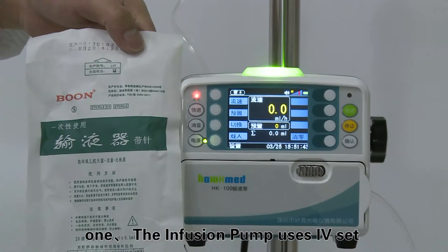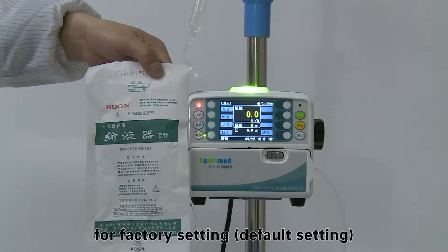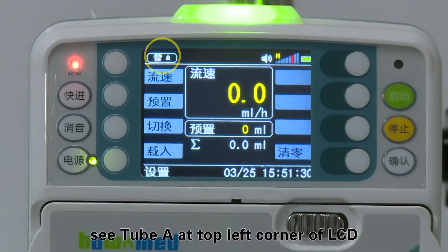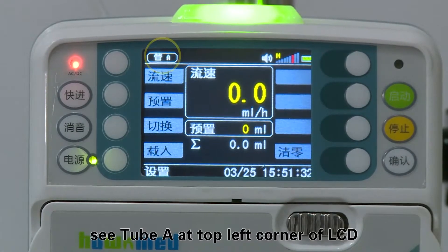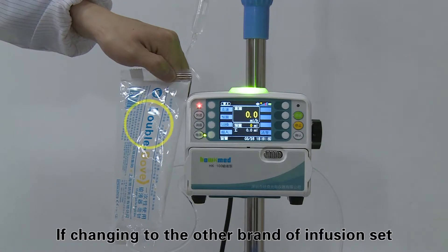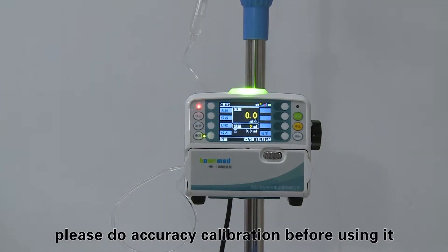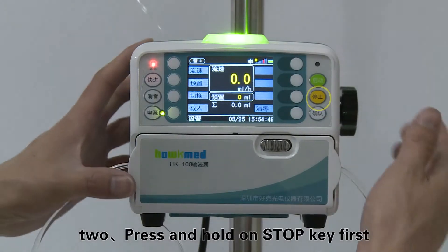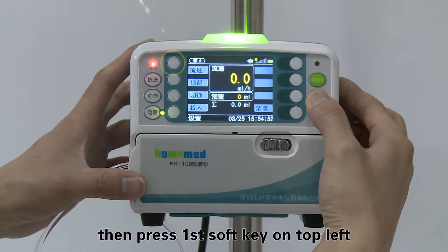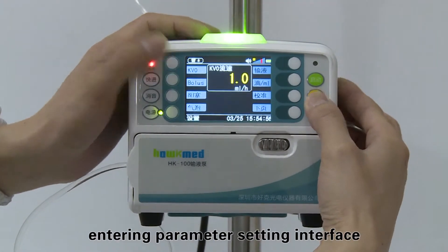The infusion pump uses an IV set under the brand of Boone for factory default settings — see tube A at the top left corner of the LCD. If changing to another brand of infusion set, please perform an accuracy calibration before using it. Step two: press and hold the stop key first, then press the first soft key on the top left to enter the parameter setting interface.